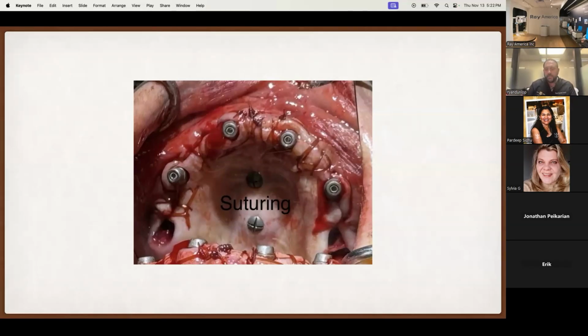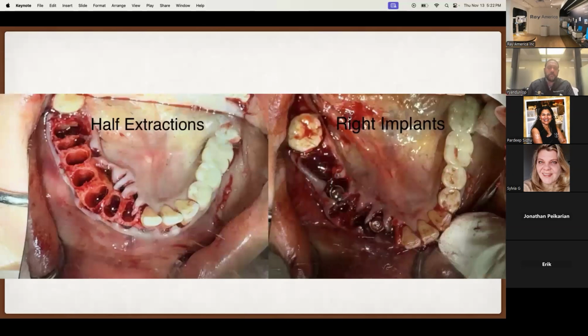So in the laboratory, when you look at exocad, you can layer your scans on top of each other based on common geometry. And on the mandible, we don't have a common geometry because the tongue is in the way, and there's no way for us to put a rigid marker in the middle of the mouth that doesn't change. So we have to use something else, and we can install markers on other parts of the mouth.